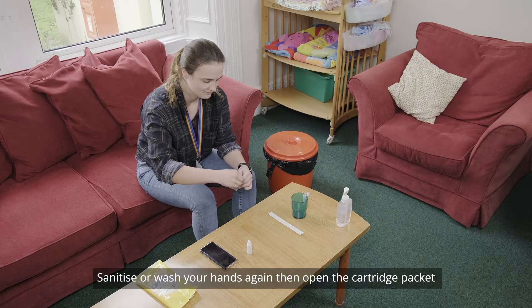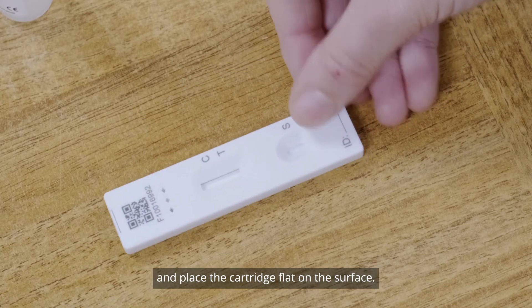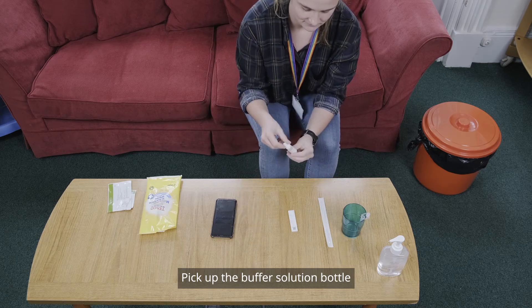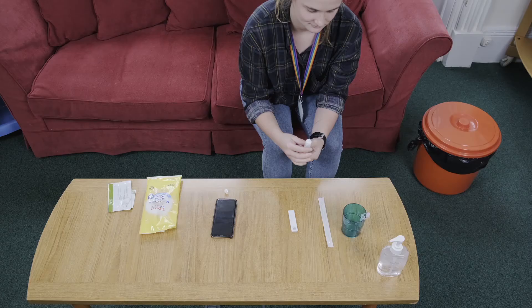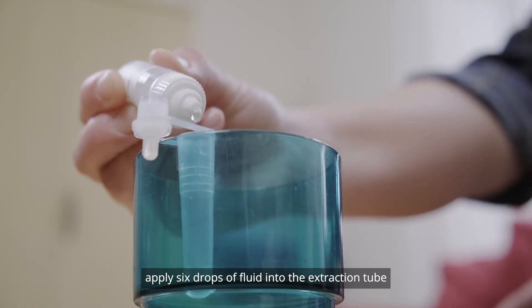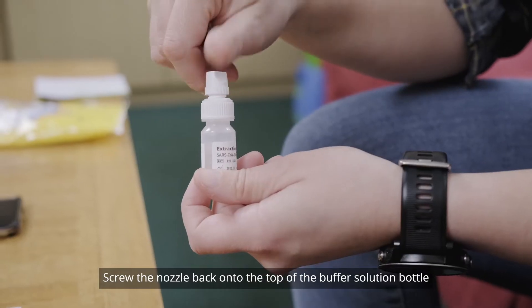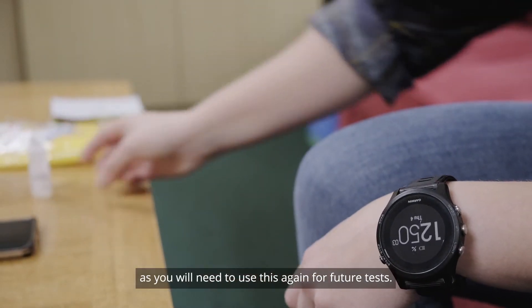Sanitise your hands again, then open the cartridge packet and place the cartridge flat onto the surface. Pick up the buffer solution bottle and unscrew the small nozzle at the top. Apply 6 drops of fluid into the extraction tube. Screw the nozzle back onto the top of the buffer solution bottle, as you will need to use this again for future tests.